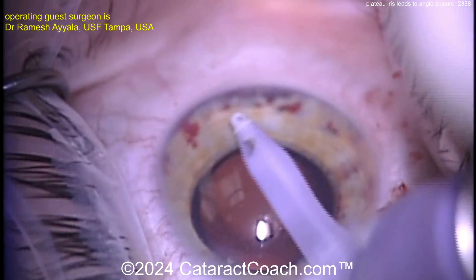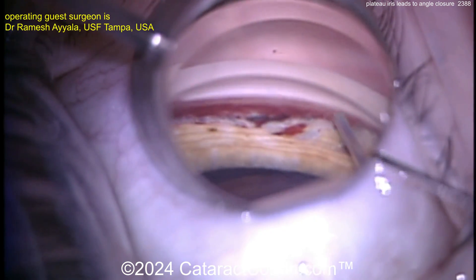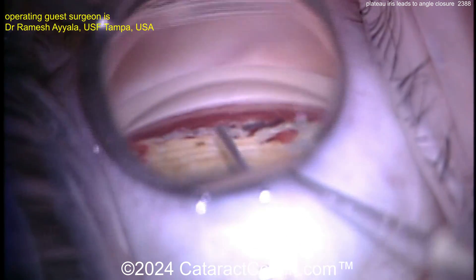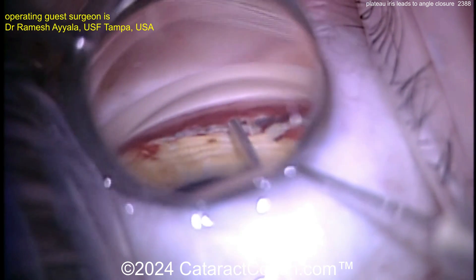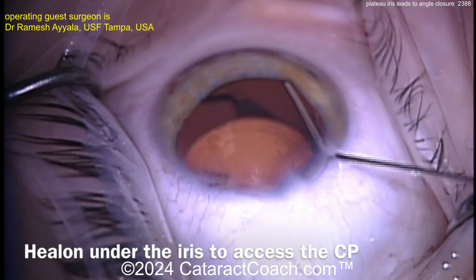Continuing the goniosynechiolysis, now evacuating out the blood, which is going to help too. Now injecting a little bit of viscoelastic just to help open it up a little bit more — there's that viscoelastic, injecting that around.